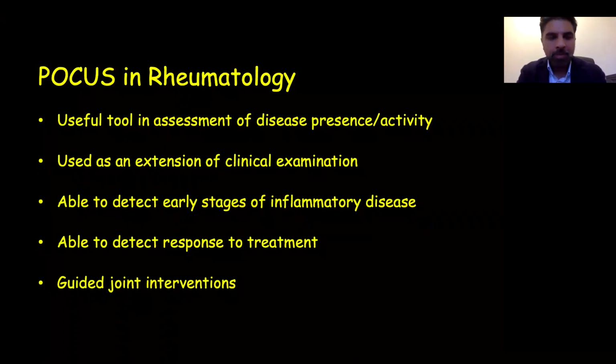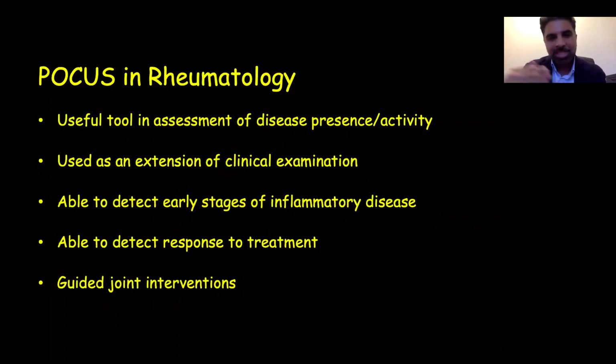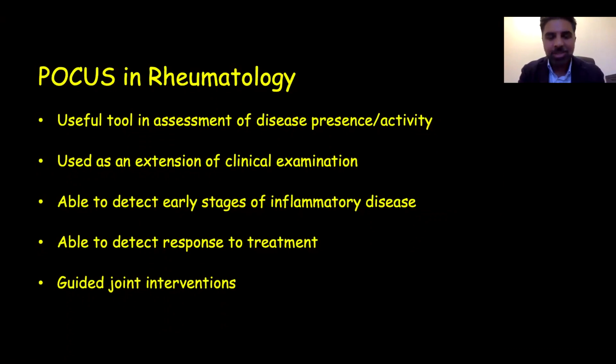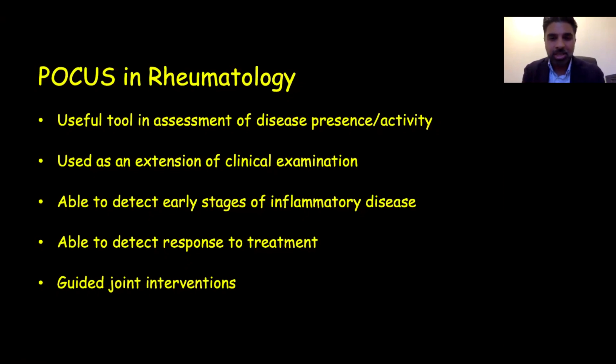One of the main benefits of ultrasound is that it can detect very early signs of inflammatory disease, and that's one of the main reasons why rheumatologists have started to learn to use this. Before, we used to send these patients to radiologists, which we still do, but it can take some time for the scan to happen, then the report to come back, etc. So it just makes sense that we can see these patients and scan there and then, and that's how we tend to use ultrasound. I think that's probably one of the main benefits.